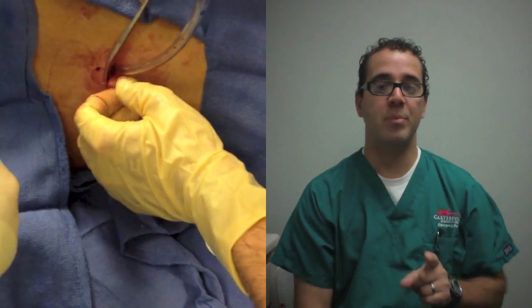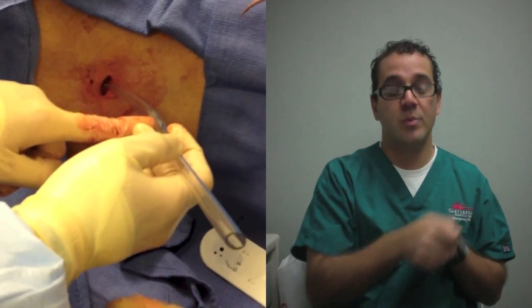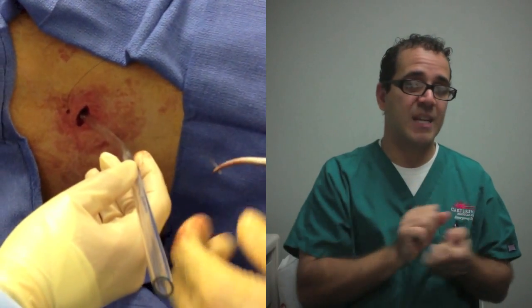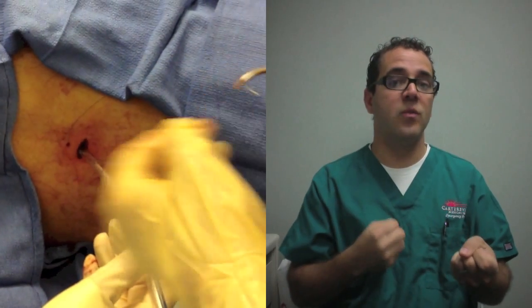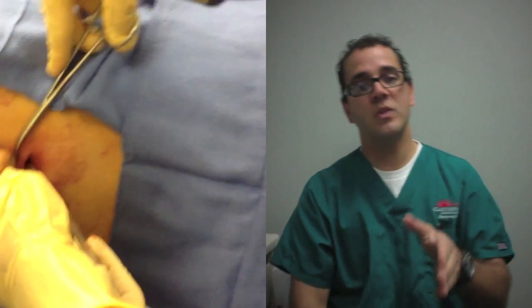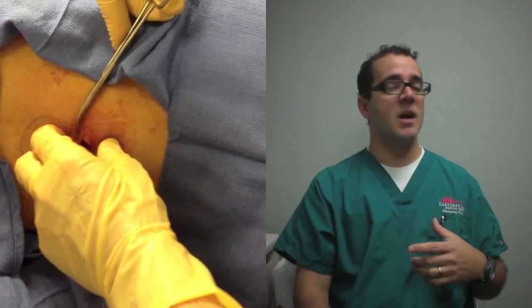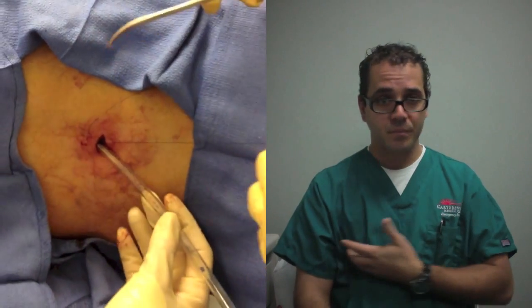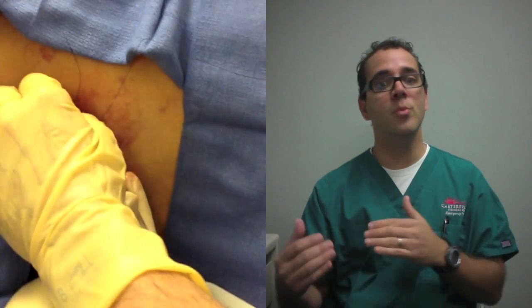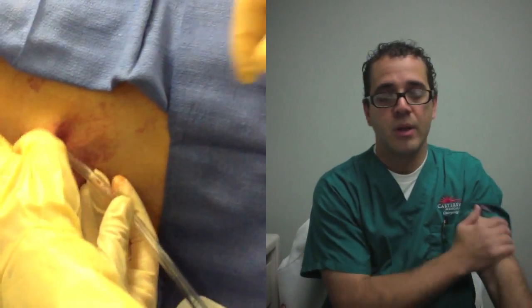So you need to make sure you're in the right place. Unless you feel you're in the space, unless you can feel your finger going through the ribs, don't push that chest tube. If you're using the trocar method, make sure you get a good flush of air, that the patient is symptomatically better, and that it threads in. If it's for a pneumothorax, you don't need to put a big tube in — it can be the really small French catheters. If it's for blood or a hemothorax, you need a thicker tube. If it's a hemopneumothorax, a thicker tube — aim it up for pneumothorax, aim it down for blood.